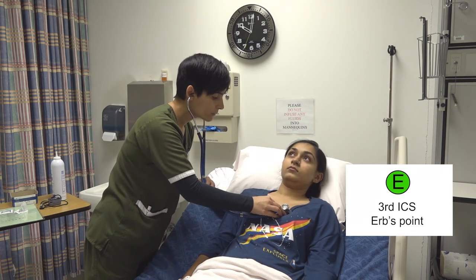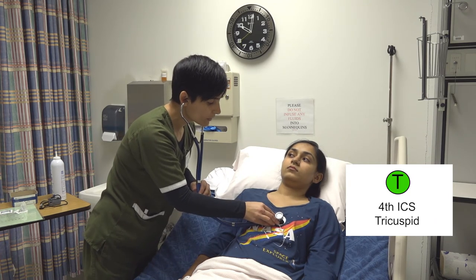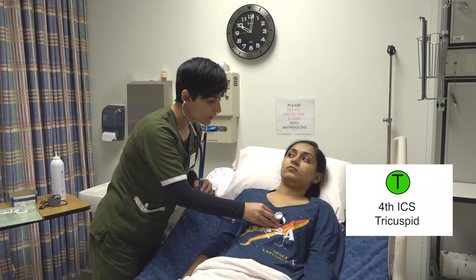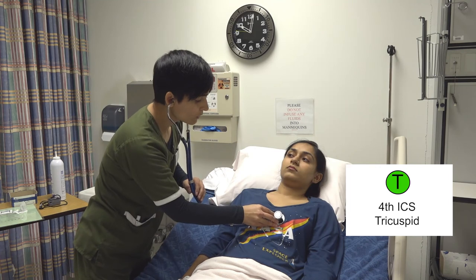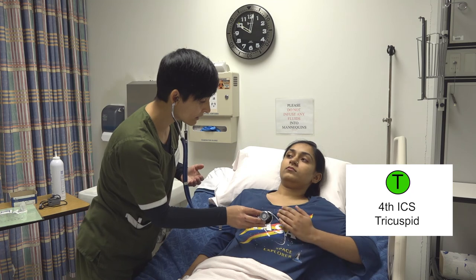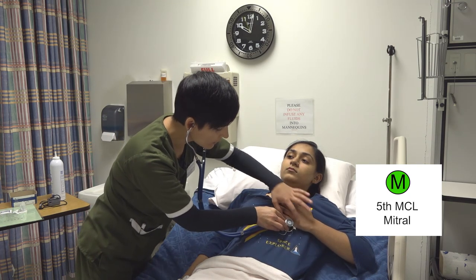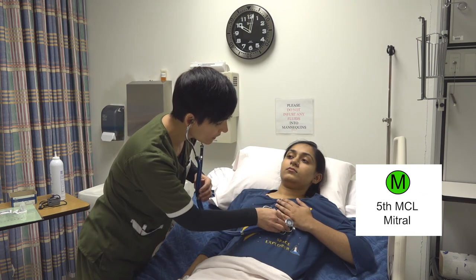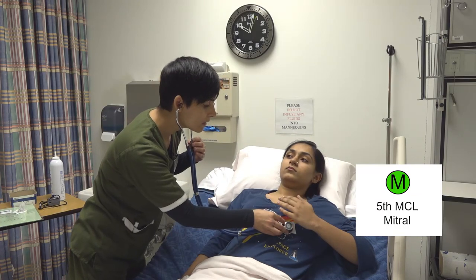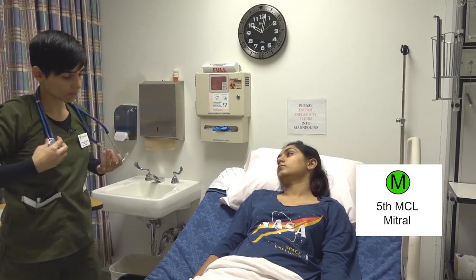Pulmonic, ERB's point, tricuspid. Now I need to go to the mitral — I'm going to have you move your breast tissue up a little bit so that I can listen underneath. And mitral is the point of maximal impulse, and that's the true apical also.